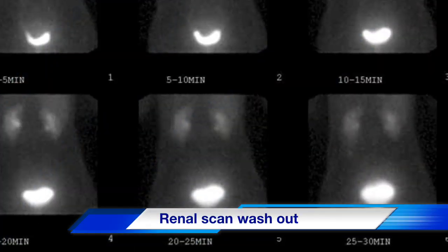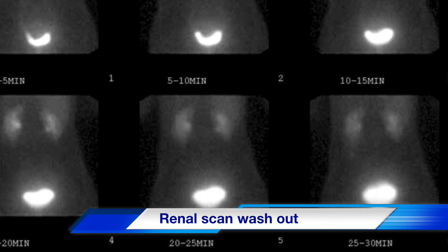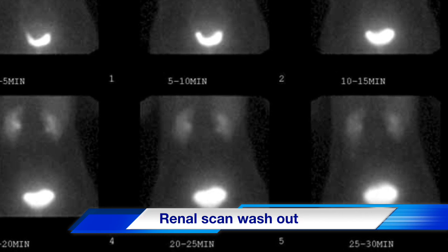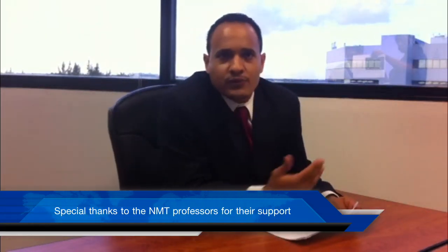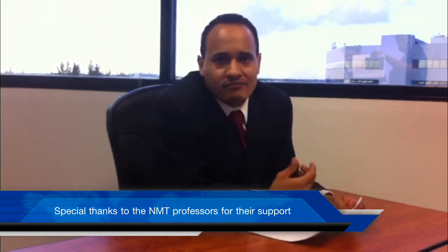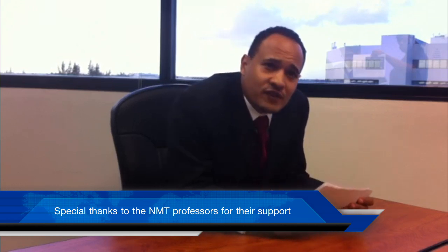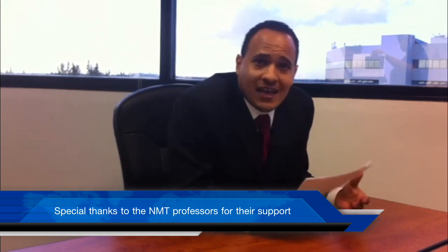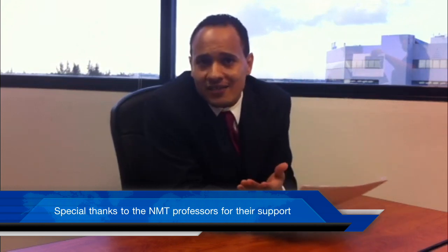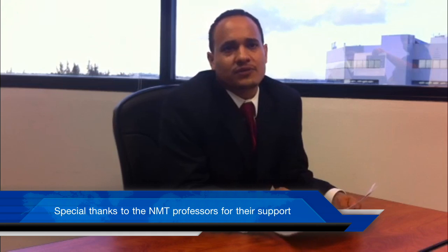Here we have a MAG-3 renal scan after Lasix administration that demonstrates no obstruction, with normal response to Lasix of both kidneys. Well, this has been very informative for our viewers concerned with the procedures and has shed some light on renal scans with Lasix. A renal scan, as we've mentioned, is beneficial in trying to identify the cause of kidney failure or obstruction, as well as give the patient and the doctors alike the opportunity to correct and treat the condition precisely.